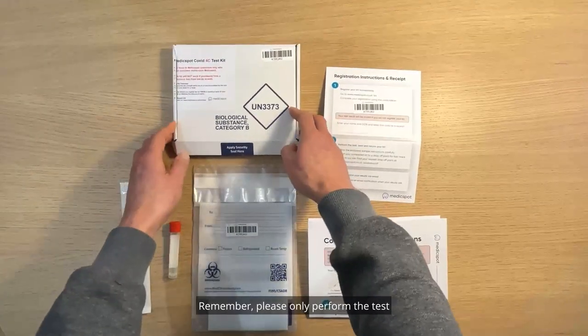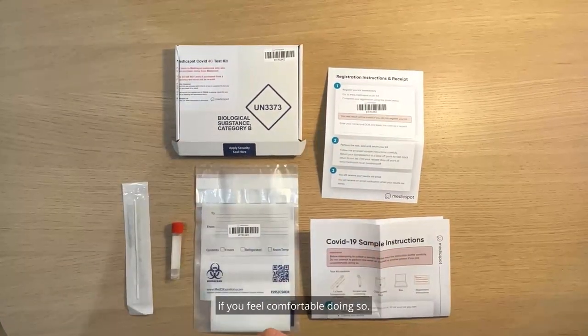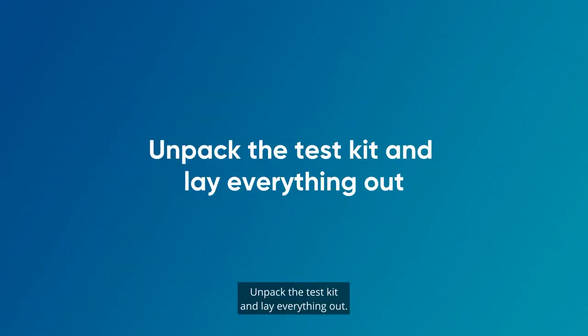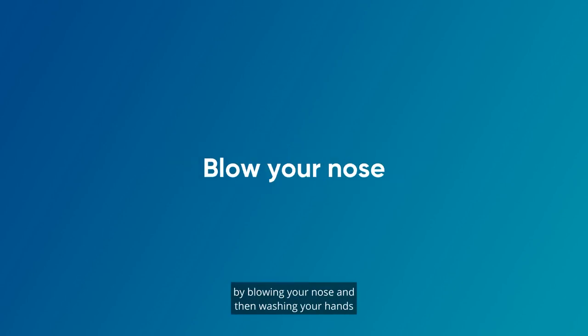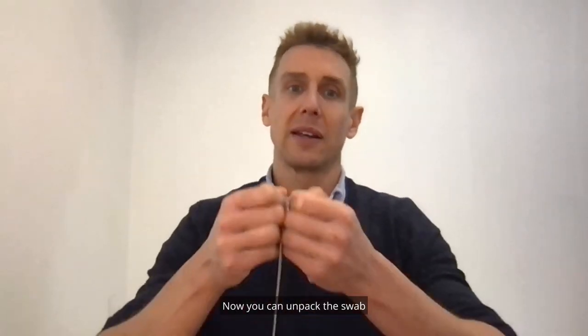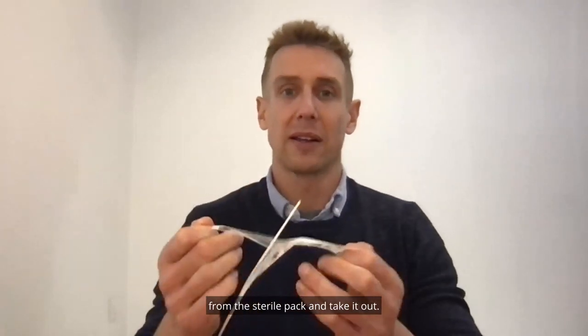Please only perform the test if you feel comfortable doing so. Unpack the test kit and lay everything out. Then prepare for the test by blowing your nose and then washing your hands with soap and warm water for at least 20 seconds. Now you can unpack the swab from the sterile pack and take it out.